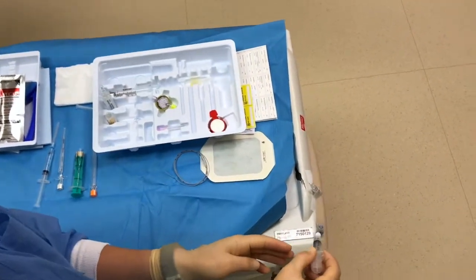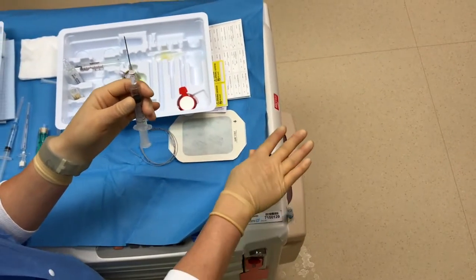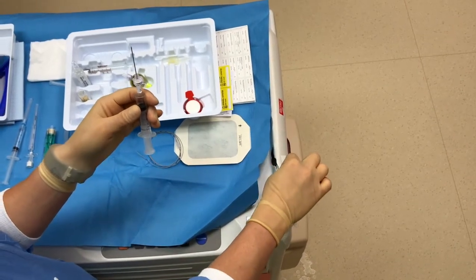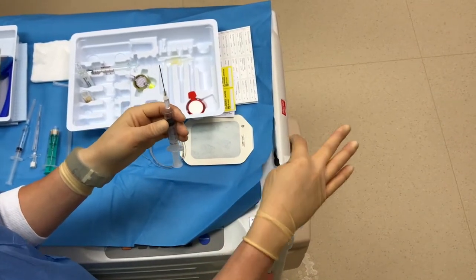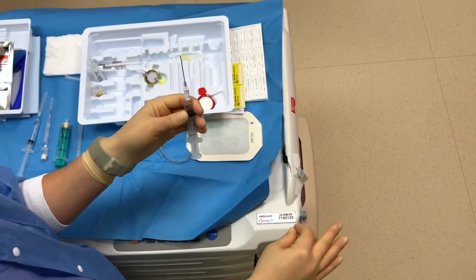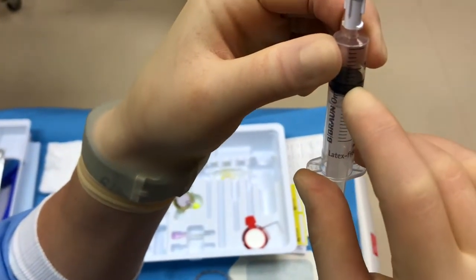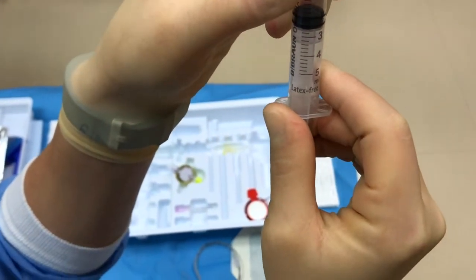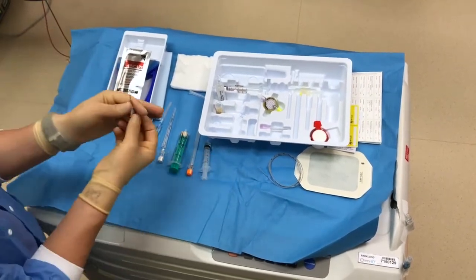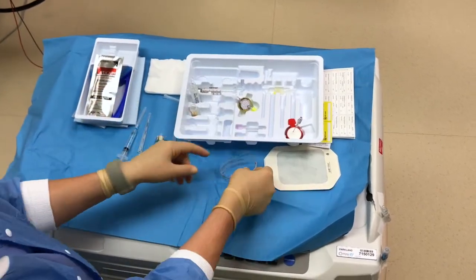And then you take your fentanyl, and you usually do 20 mics of fentanyl. So it would be 1.4 to 1.6 cc's or milliliters of your bupivacaine, combined with 20 micrograms of fentanyl. And that on this syringe is going to be 2 clicks. So you see 1, 2 clicks. This is our spinal dose in here. Lay that down and protect the needle. I already took out my catheter, but that would come next.